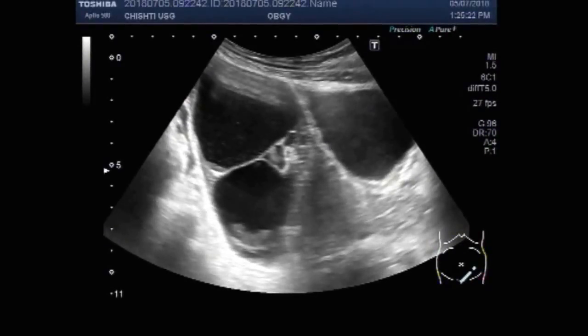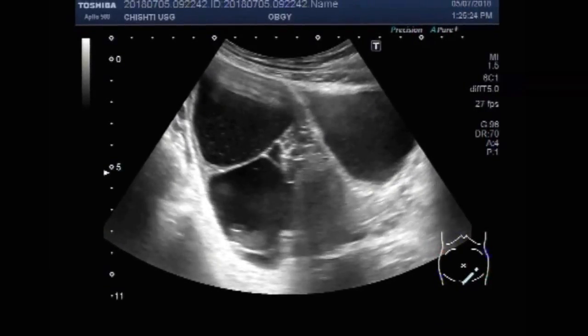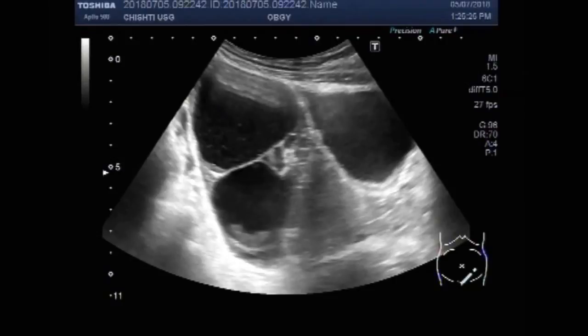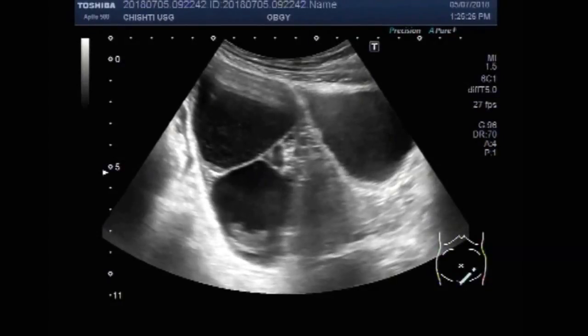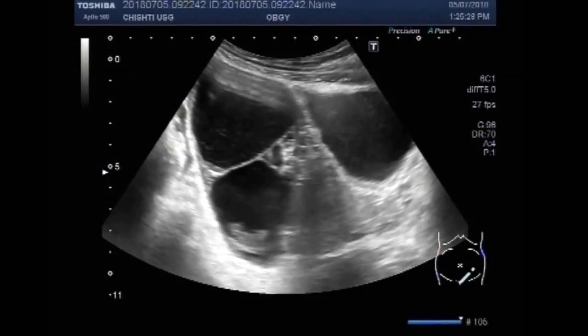Now you can see the corpus luteum. Please click the like button. Thanks.